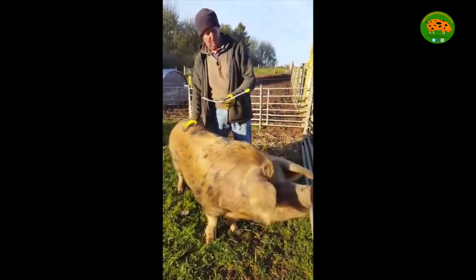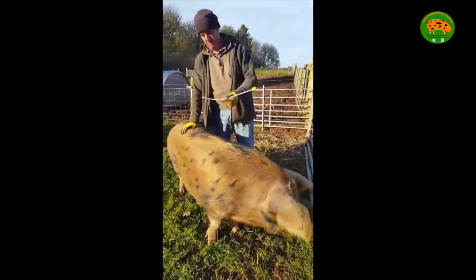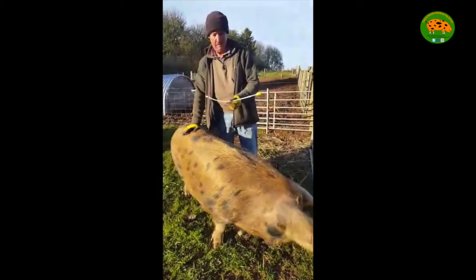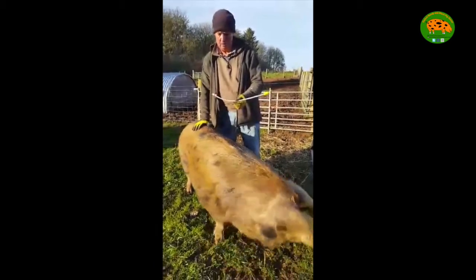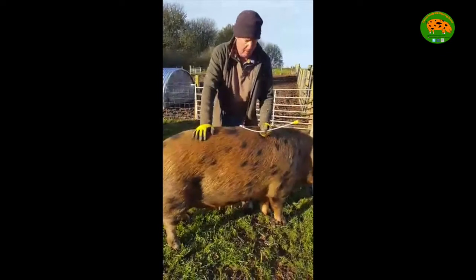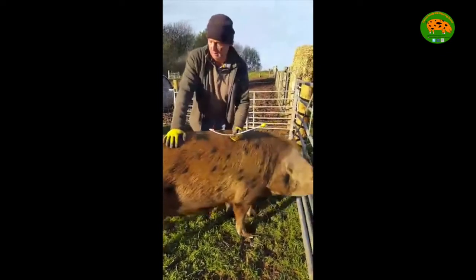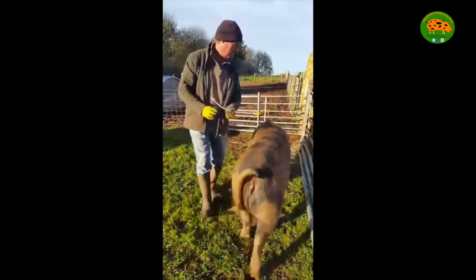So that was a 100ml bottle we gave to her there. I assume we've got about 70 to 80ml in her. It's 2 o'clock in the afternoon, we're going to run out of daylight to do it again today, so we'll try another 100ml bottle first thing in the morning and another one last thing tomorrow. Hopefully that will be the first successful one.